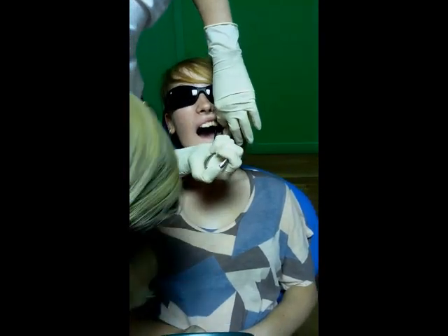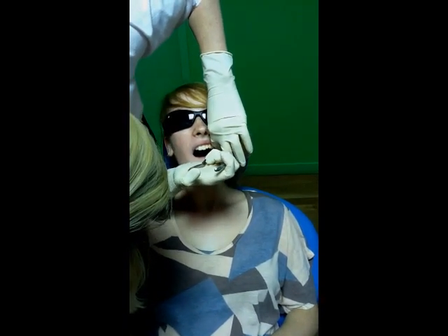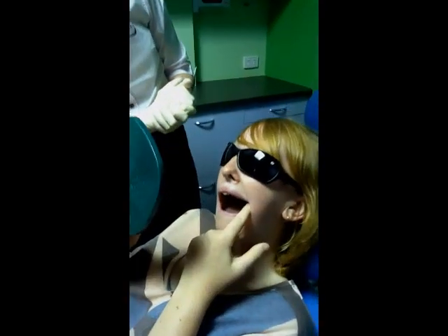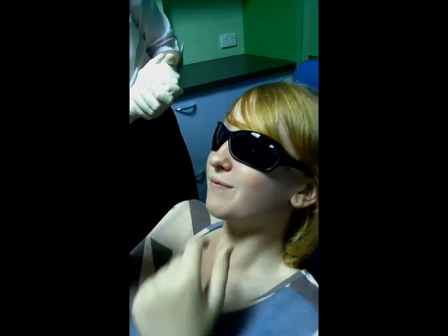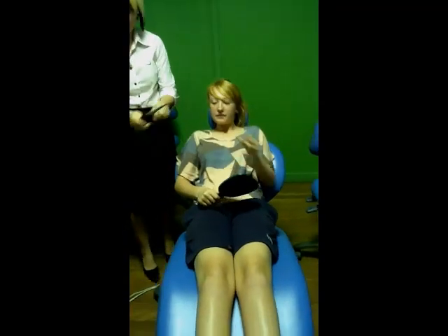This is the last one. Well done, Shay. Do you want to have a look at the separators in the mirror? You'll probably be able to see the bottom ones a little bit easier. Do you see them going in between your back teeth there? Yeah. The ones at the top — see them from the side perhaps? Yeah. That's fantastic. Good job. I'll take the glasses for you if you like.